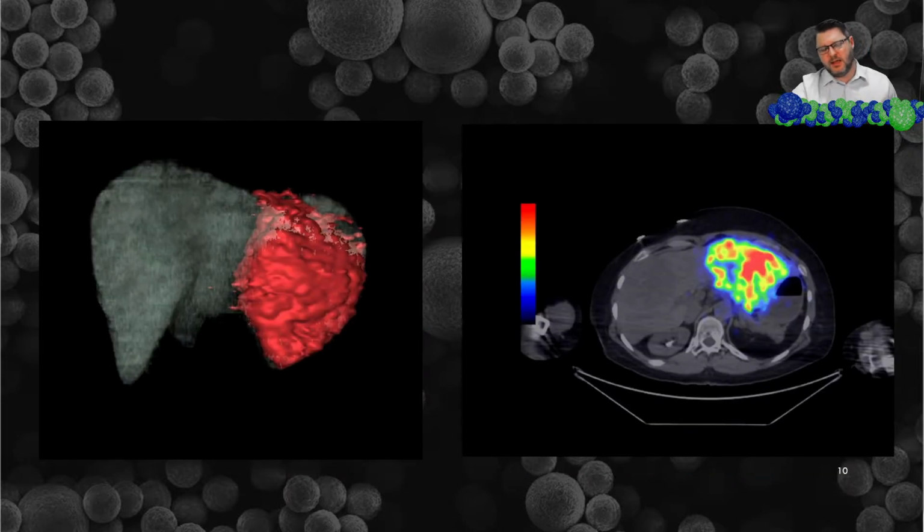If you look to the left, this right here is a PET CT image post Y-90 treatment. If you look at the green, that is the outline of the liver. That is the liver itself. But this bright red is where the Y-90 beads localized and got wedged and stuck in the capillary beds inside the tumor. So you can see that almost whole left lobe of the liver is treated pretty densely, but then this right lobe is almost completely, I would say completely untreated, which is the target. You don't want to treat good liver parenchyma.